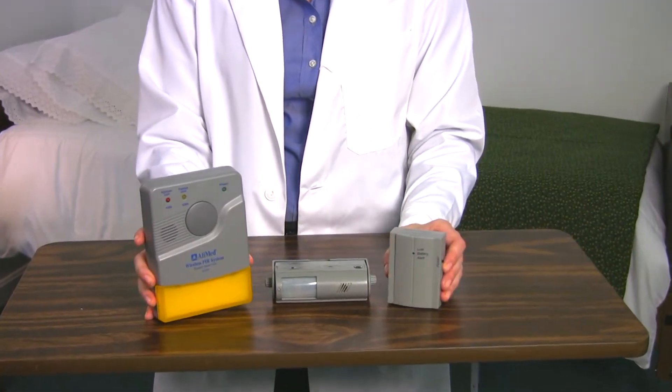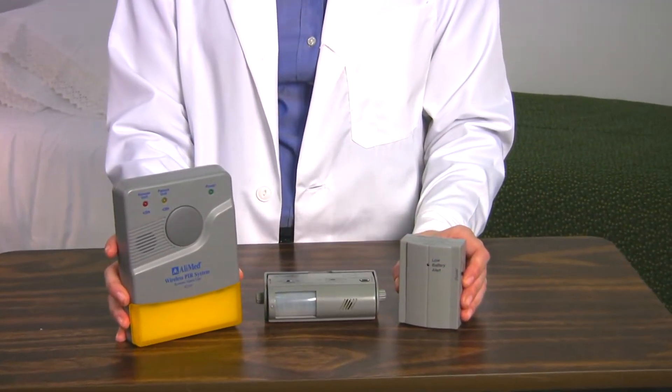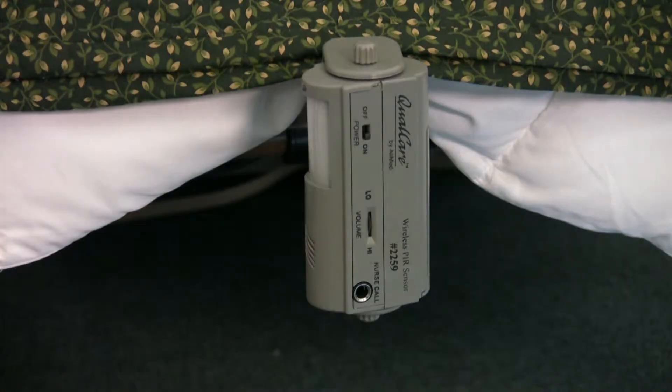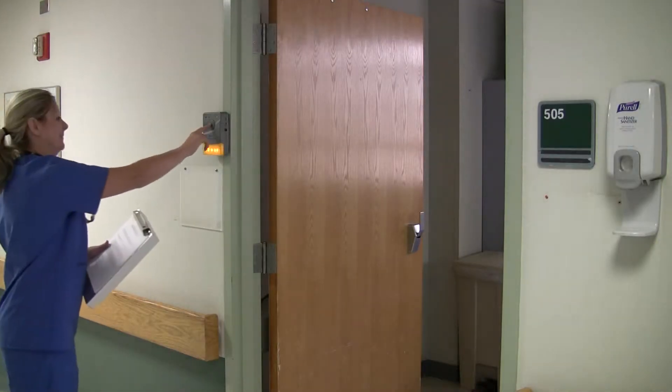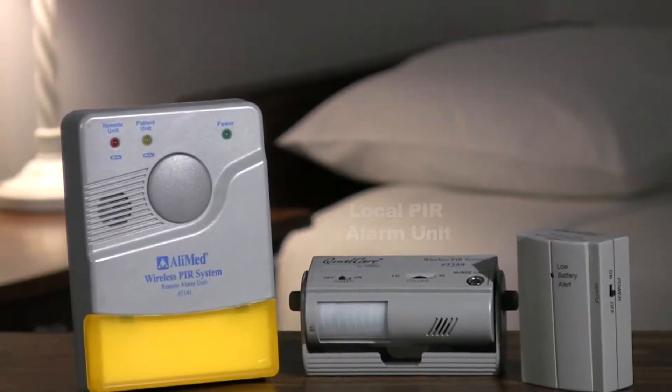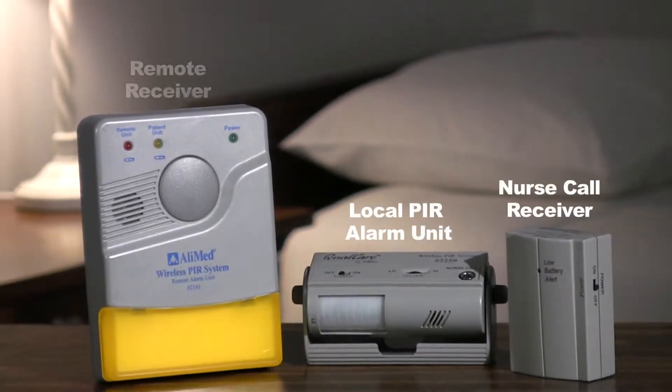System 4 combines PIR systems 2 and 3, allowing your alarm system to alert at bedside, at the nurse's station, and at a remote location up to 100 feet away. It includes the local PIR alarm unit, nurse call receiver, and remote receiver. The System 4 configuration gives your PIR alarm the widest alert range, which in turn helps increase staff awareness to patients attempting to rise. It is the best option for extra safety and for increasing staff response time for patients in danger of falling.